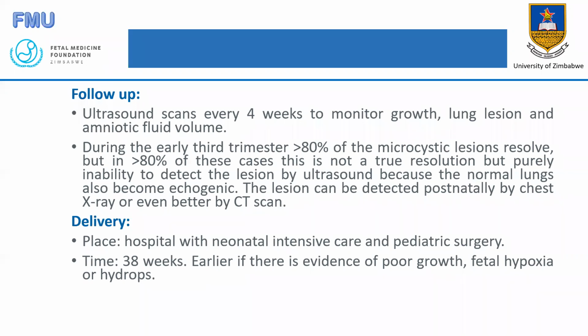But in greater than 80% of the cases, this is not a true resolution, but purely inability to detect the lesion by ultrasound scan, because the normal lungs also become echogenic. The lesion can be detected postnatally by chest X-ray or even better by CT scan.